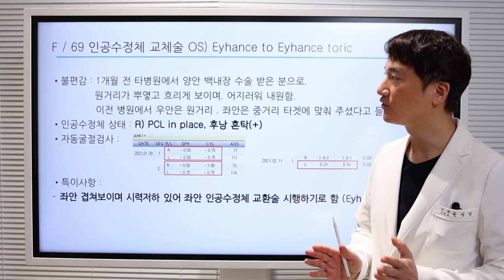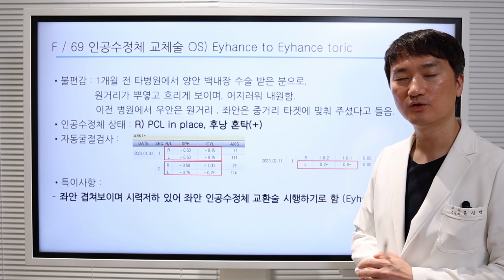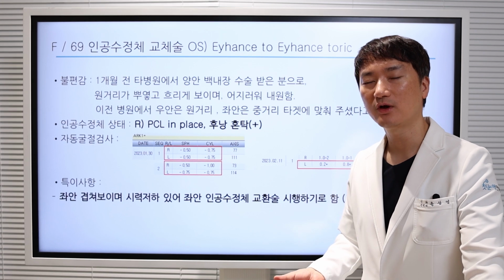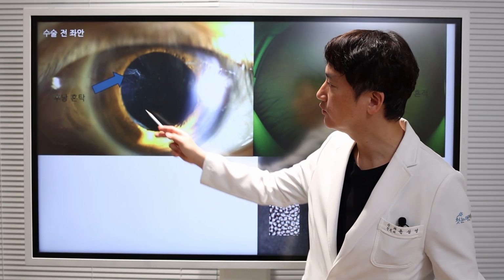To address this problem effectively, if the cataract surgery was performed recently and the procedure was executed correctly, choosing to replace the lens might offer the fastest route to recovery. Therefore, let's proceed by dilating the left eye to continue with the treatment.